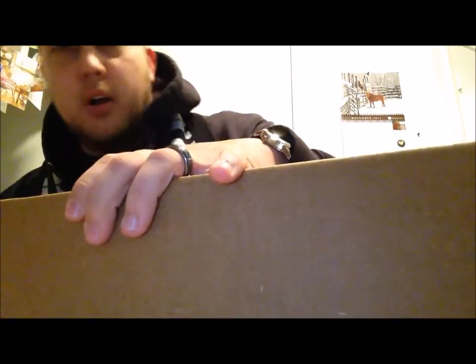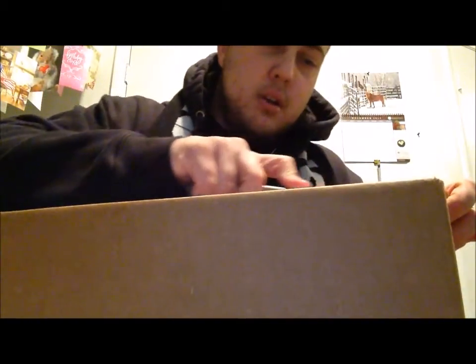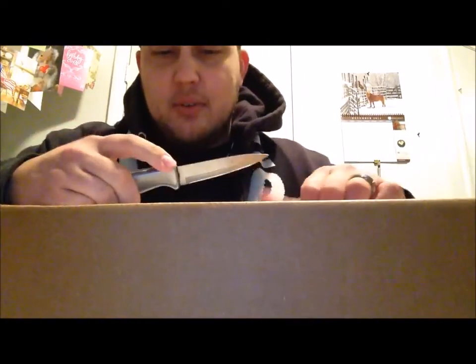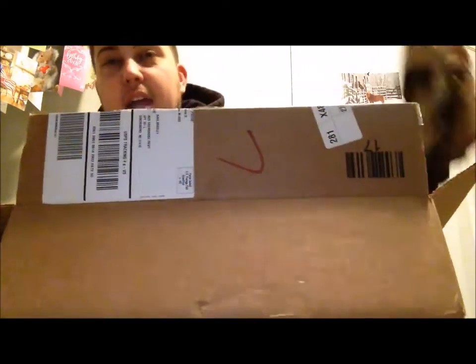I ordered it on allheart.com — first time ever ordering anything off allheart.com. The stethoscope is a custom color and I got it engraved, which I just remembered, and it was I think $85 after that. Shipping was astronomical — standard shipping, like 10 business days, and it was like $15 for shipping alone, so it ended up coming out to a little over $100, which is kind of ridiculous in my opinion.